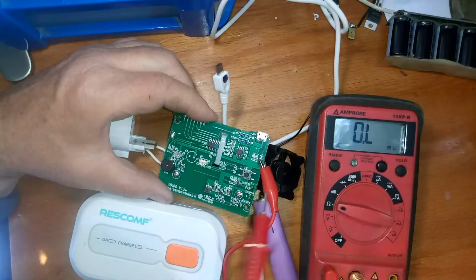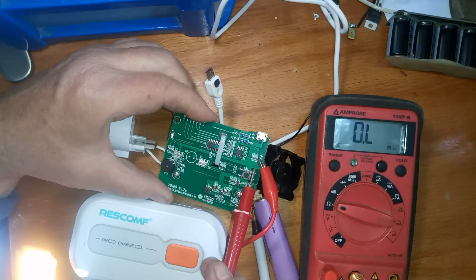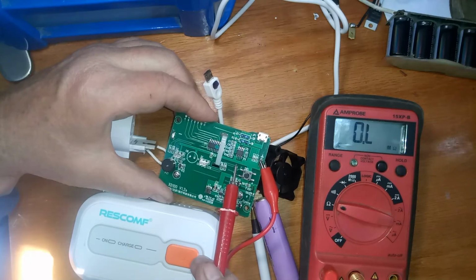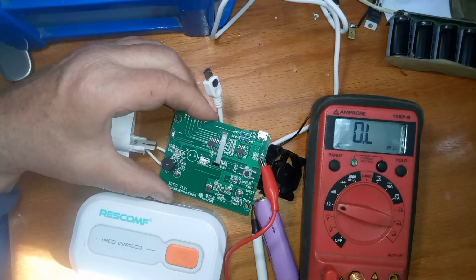But it could be these bypass capacitors, which are across the battery. So it could be them. So, I'm going to turn it off a second. You're going to see this live. And what I'm going to do is unsolder that.